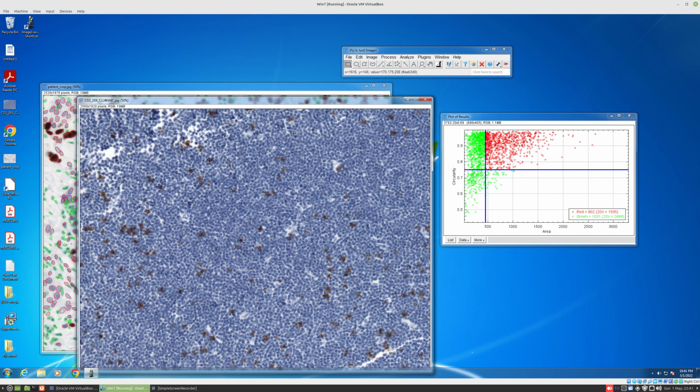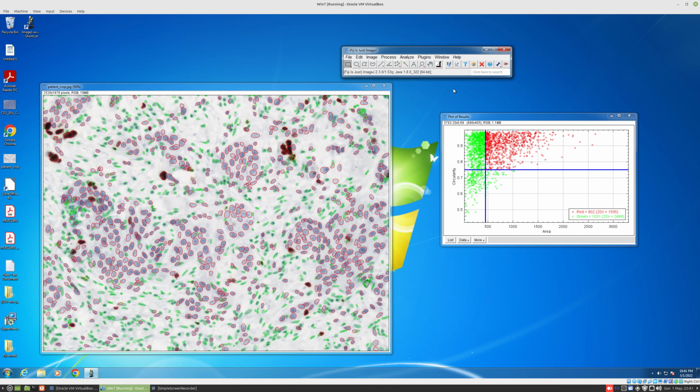That will take too much time. That will take approximately 1 minute, so we won't do it. So basically, this is it.